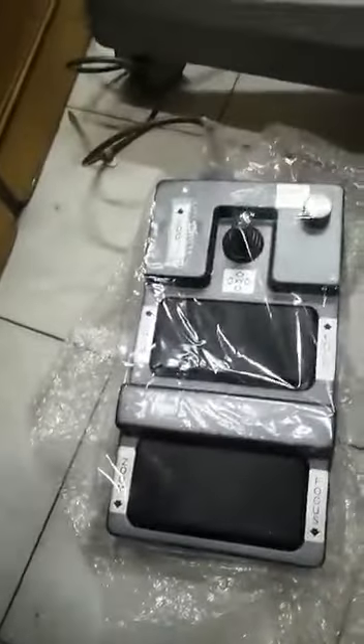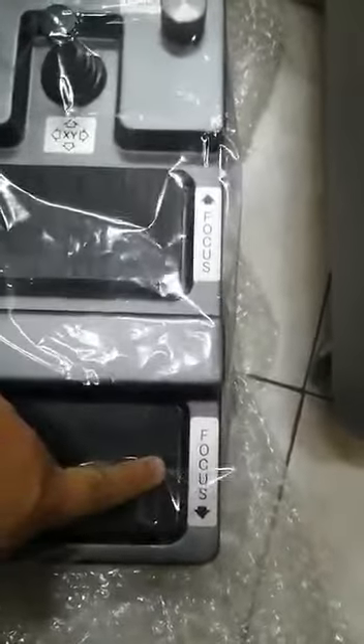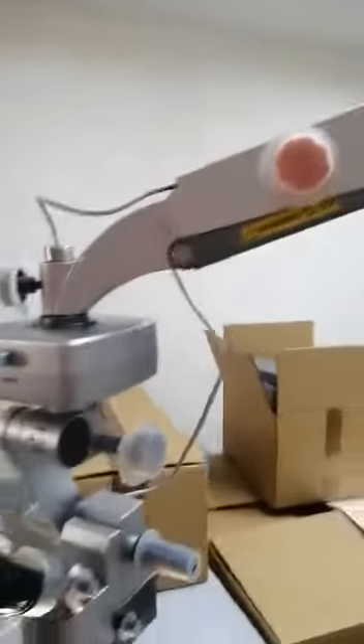This is the foot switch of the microscope, with light on/off switch, XY coupling knob, zoom up, zoom down, focus up, focus down. This is the base and microscope body, Takagi OM9. This is the XY coupling.